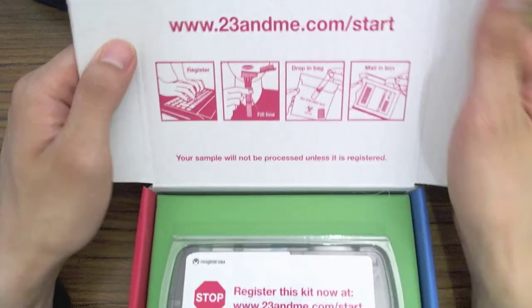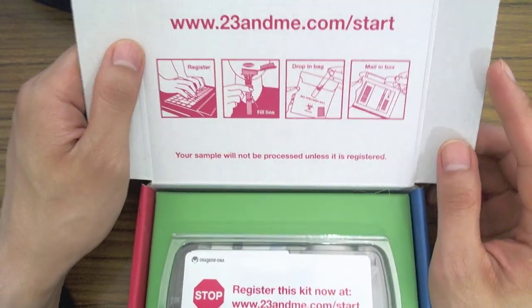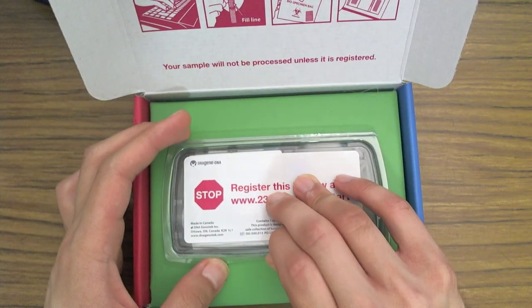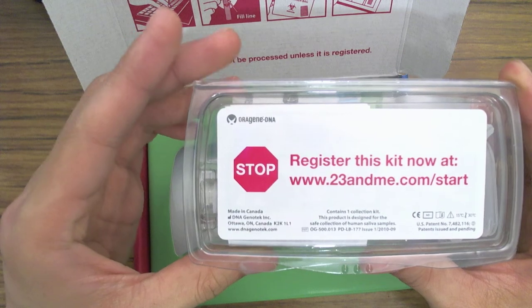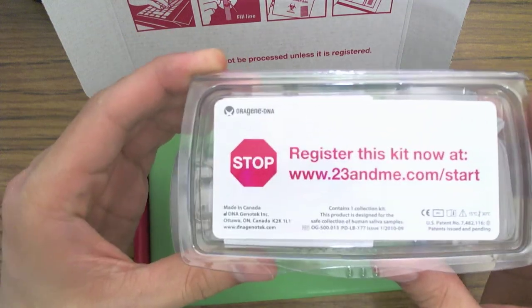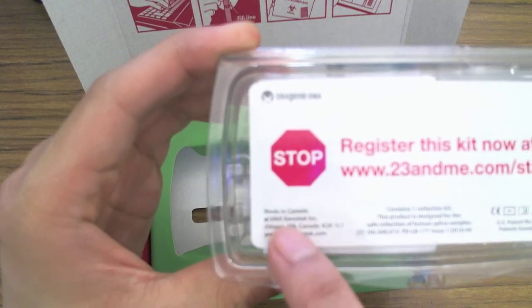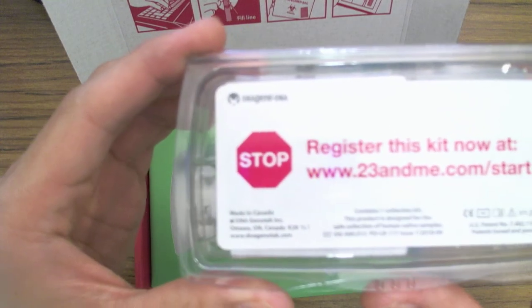What you need to do is go to 23andMe.com/start and then register it — I'll show you how to do that in a minute. This is the box it came in. You can see it's made in Canada. It looks like it's outsourced to a third-party provider, DNA Genotech, based in Ottawa, Canada.